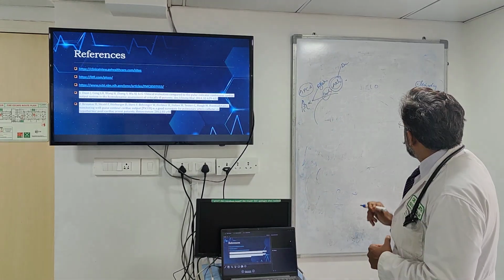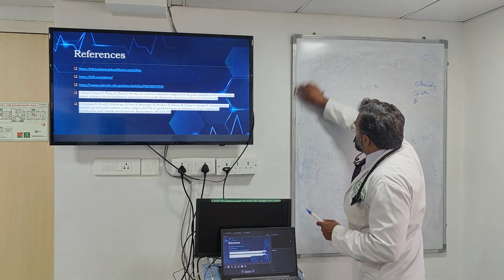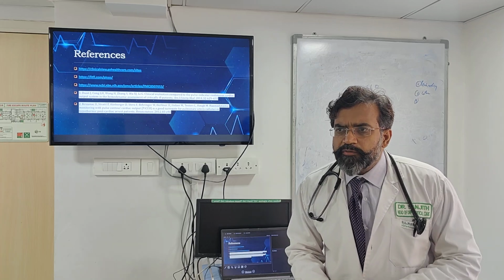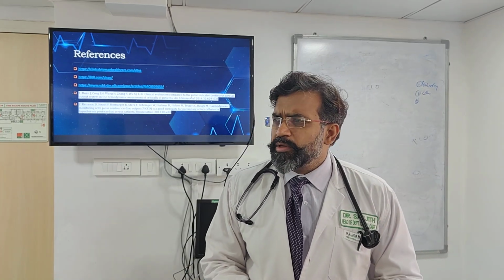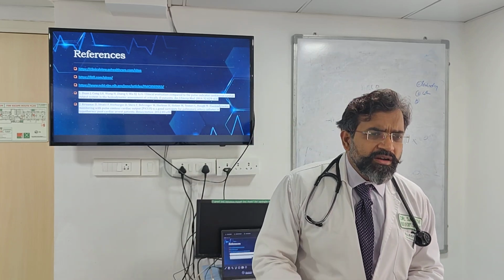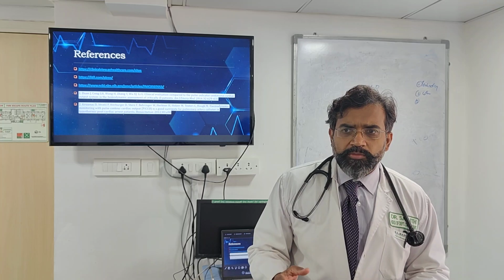Now, where would you want to use this? Let's take the example of an obese person who has come in with diabetes and hypertension, who basically has got a patch in the lung, and the heart is normal.